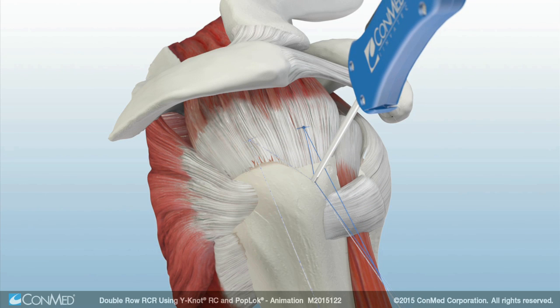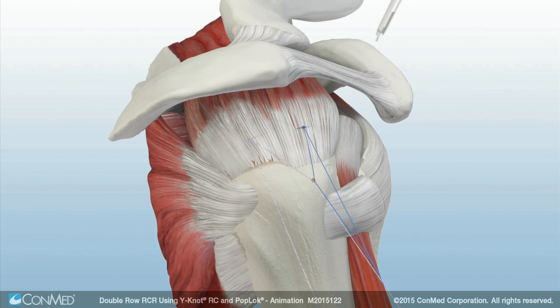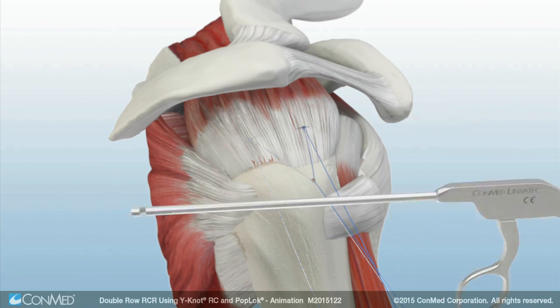The pop-lock is deployed by squeezing the black handle, causing an audible pop to be heard. The suture tails are cut with a katana suture cutter.